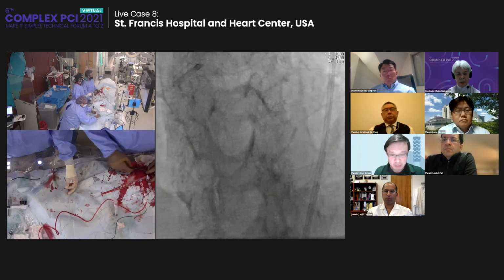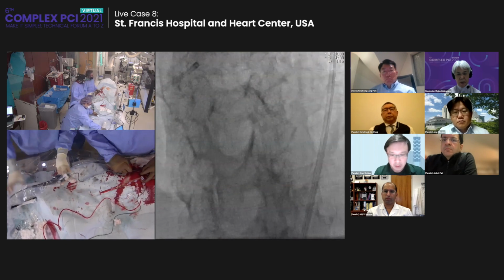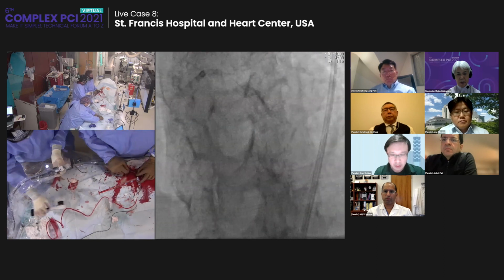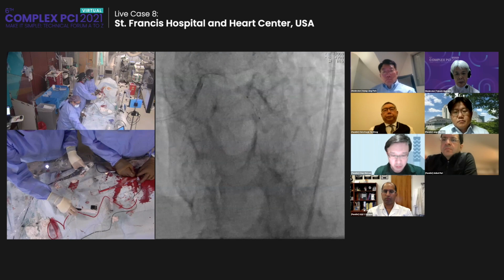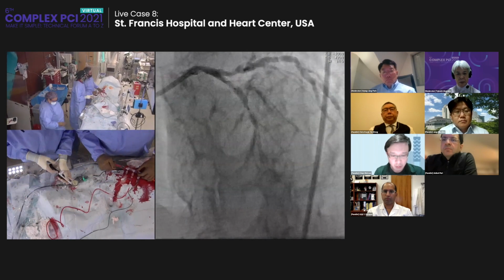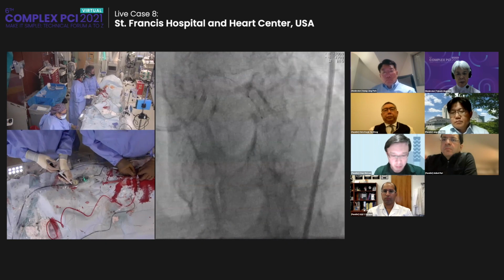I think if I have fracture and I can deliver that stent, I'll be able to use a high pressure balloon and get expansion. I know some of my colleagues don't do that, and they'll always test. I know when I do CSI and I see fracture, I always go ahead and stent. I know when I work with Jeff Moses, who works in our lab as well, he likes to check it out with a balloon. We might have to rewrap this in the guide, Rich, if it can't go.